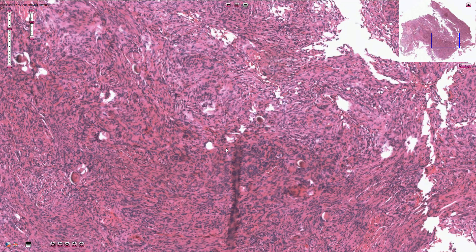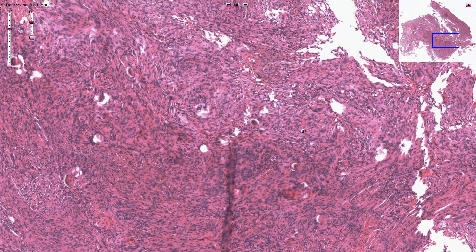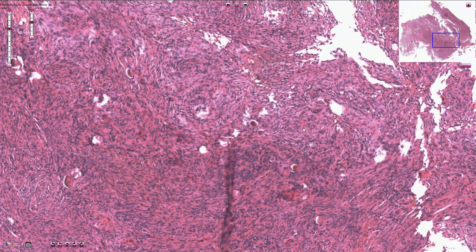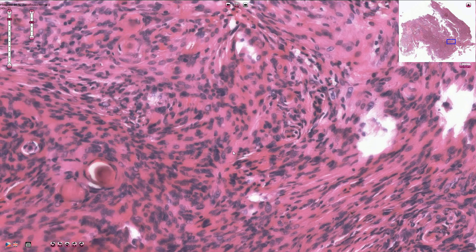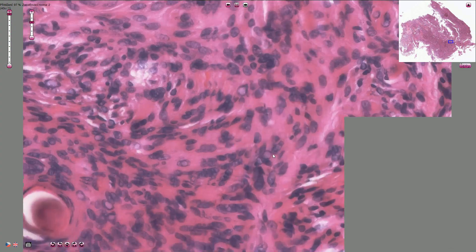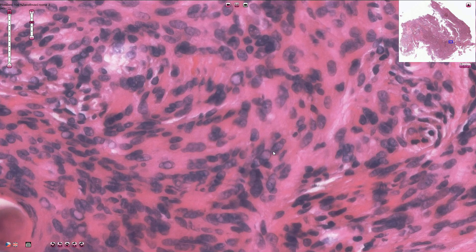The tumor is also typically associated with multiple small spiral-like or whorl-shaped structures, seen here in several locations throughout the slide. On higher magnification, we can see that the cells are quite uniform and they have oval-shaped nuclei.